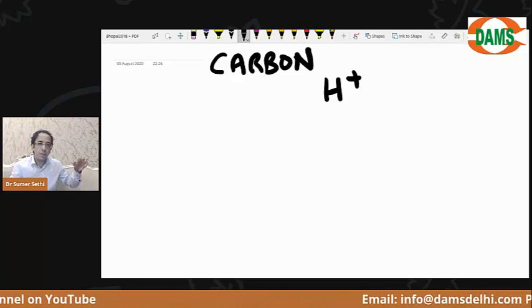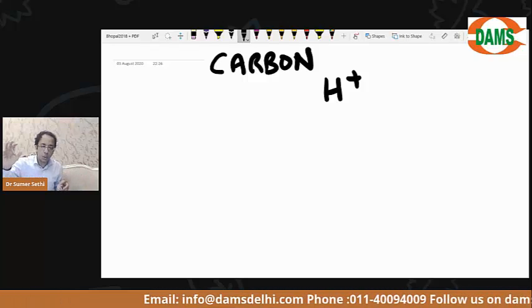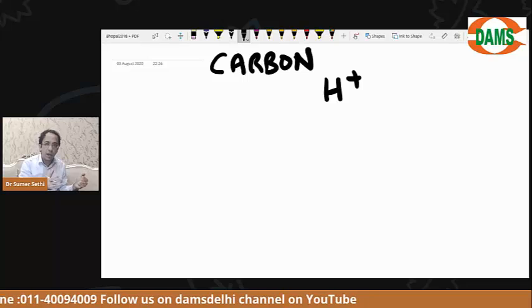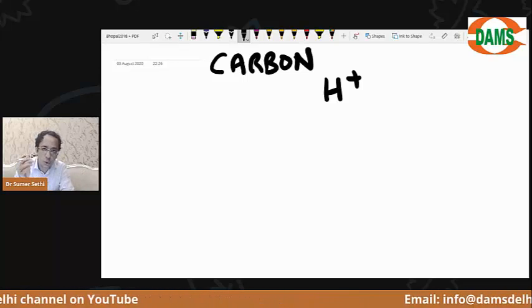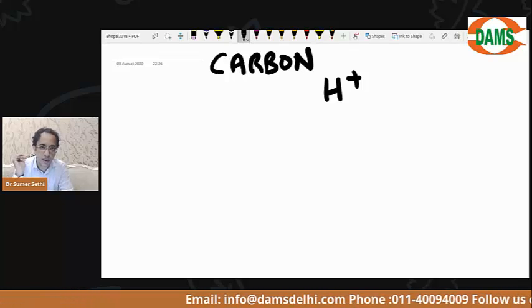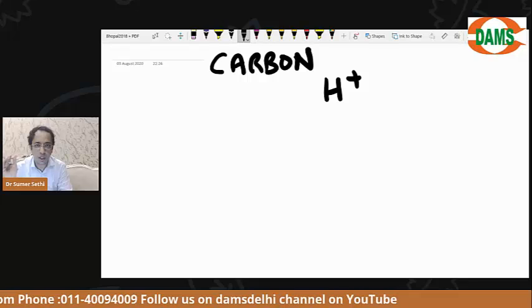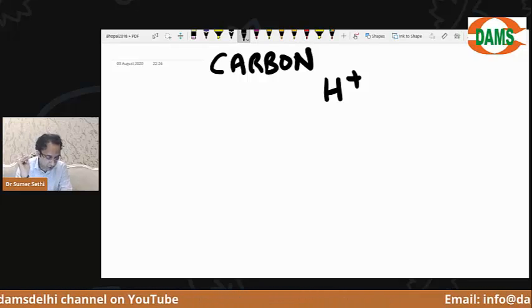Bone will have a different property in MRI compared to fat or brain tissue, because it is not just hydrogen that we have in our body; we also have a carbon lattice. Are you able to understand this? That is why different tissues exhibit different T1 and T2 relaxation times, and that is why their appearance on MRI is different from one another. Everybody follows? Okay.